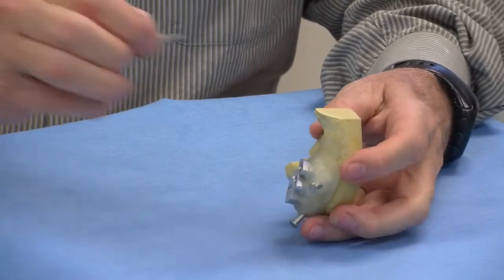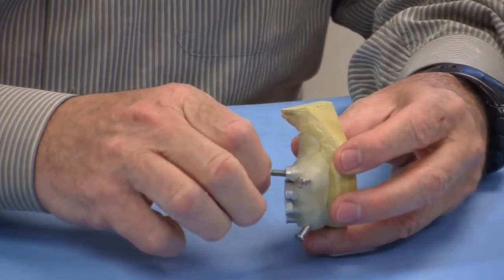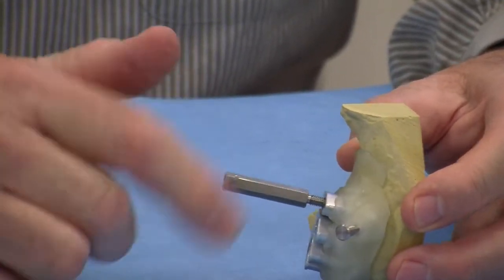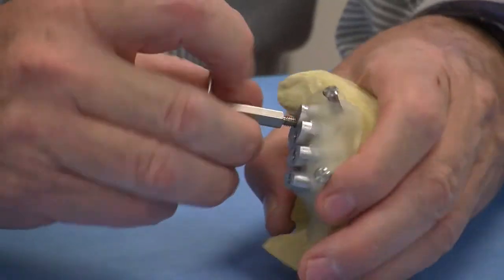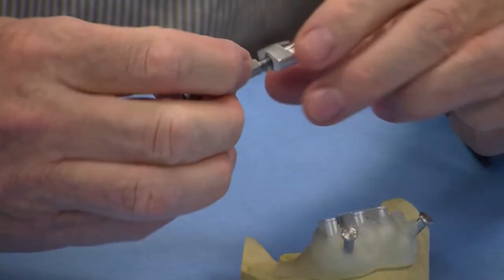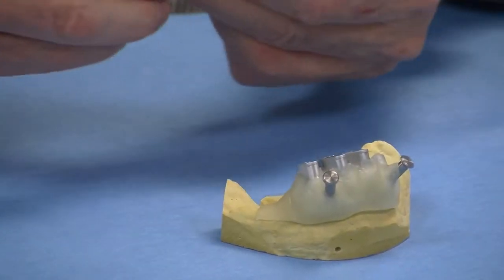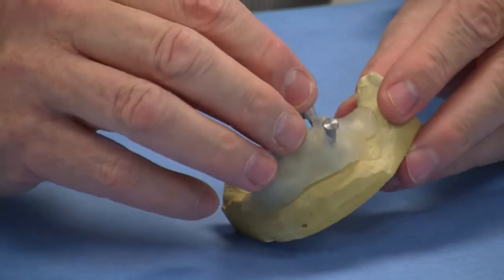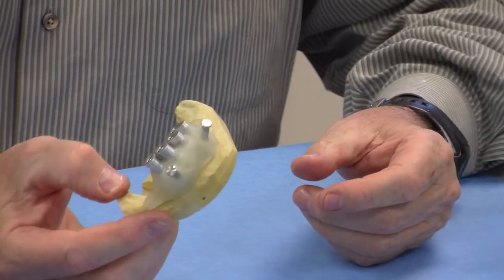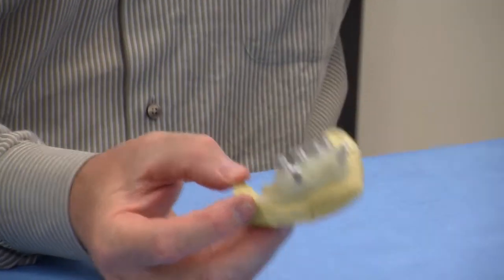And also using a guide holder pin, we can put the extractor in place and pull it one by one, and reinsert it carefully. So now we can actually cure the model for an additional 6 minutes.